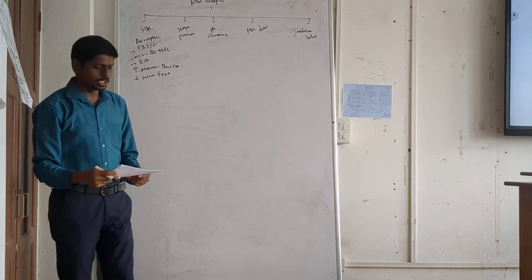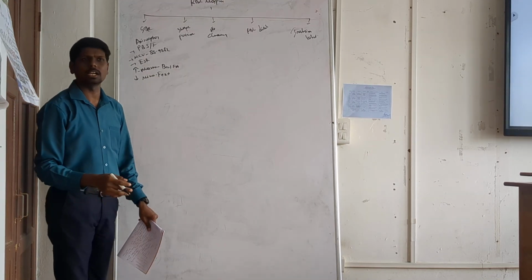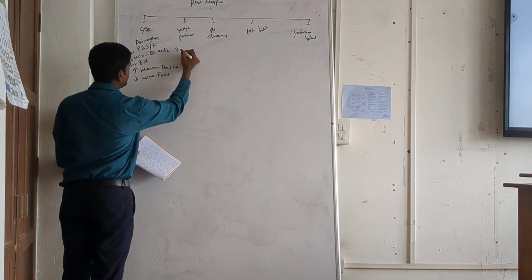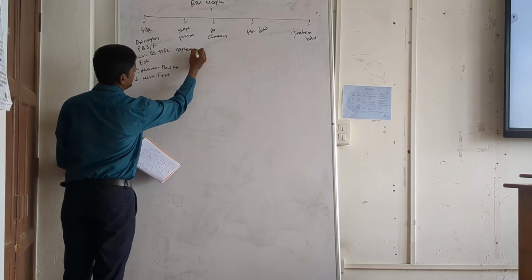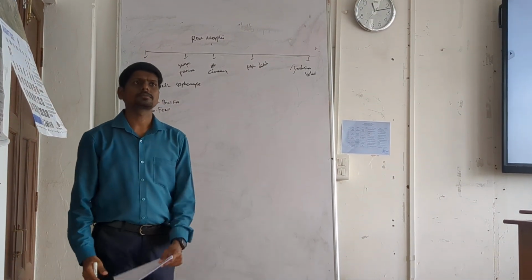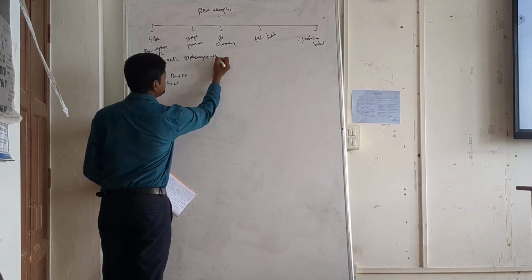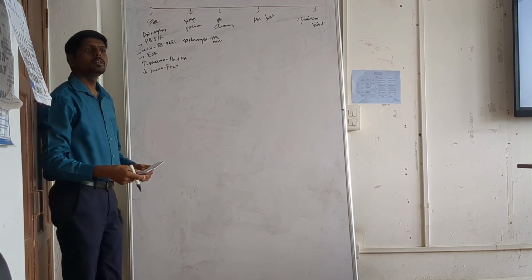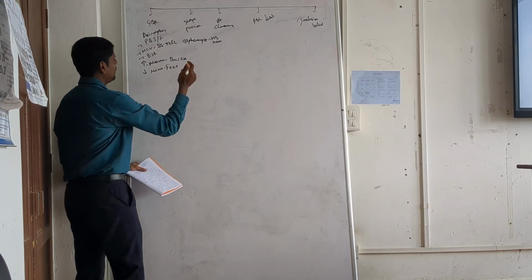Very good. Then we started discussing shape variations, that is poikilocytosis, right? So we discussed, first one, spherocytosis, spherocyte. What is the primary reason for spherocytosis? Hereditary spherocytosis and hemolytic disease of newborn. These two are major causes.